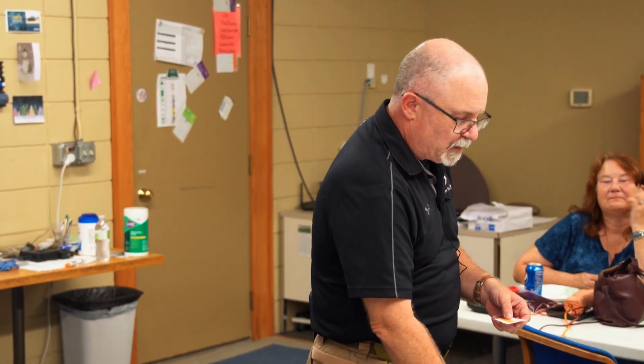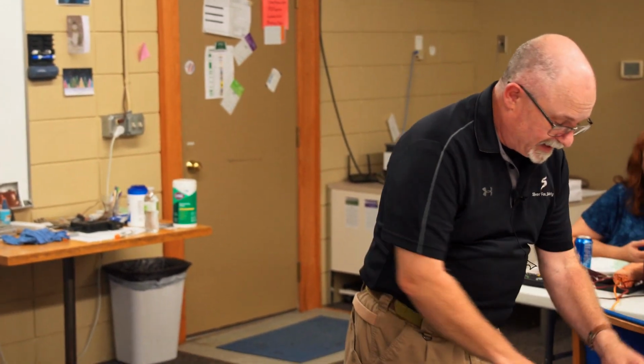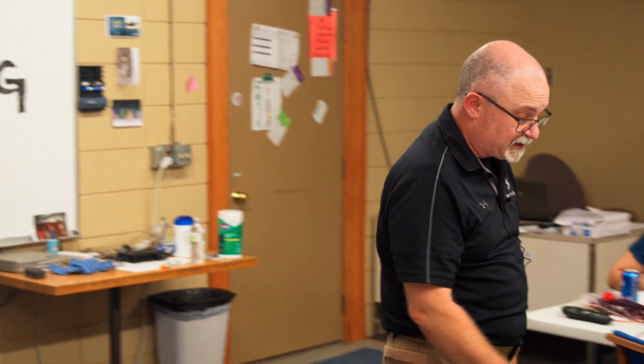One of the things very early in my career here was that if EMS hadn't used iodine to do the IV start, they would change the IV out immediately. And for the longest time, they would only leave an EMS-placed IV for no more than 24 hours. Stupid. Early on, it was a bit of a 'we don't know if we trust them' kind of thing. But iodine and alcohol, in my experience, doesn't make a bit of difference. It cleans everything up that way. But you can do the iodine first and the alcohol after, and everybody's good, especially if they're really sweaty or dirty.